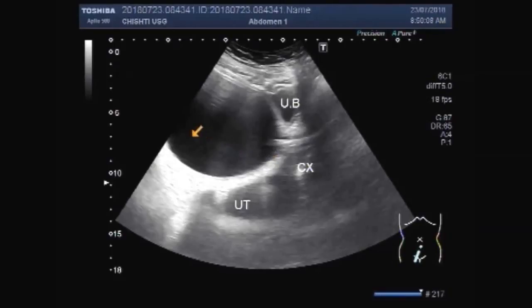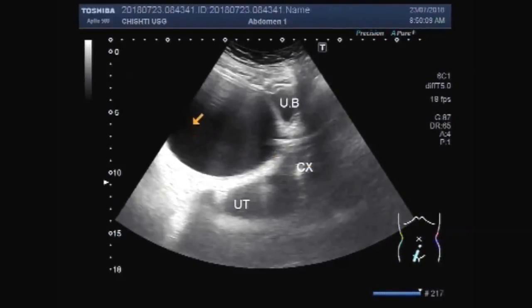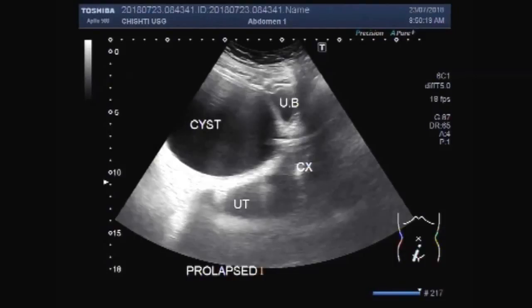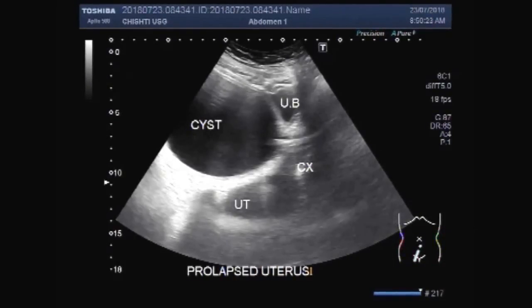This one is a dry ovarian cyst. This one is also a dry ovarian cyst. The uterus is completely prolapsed.